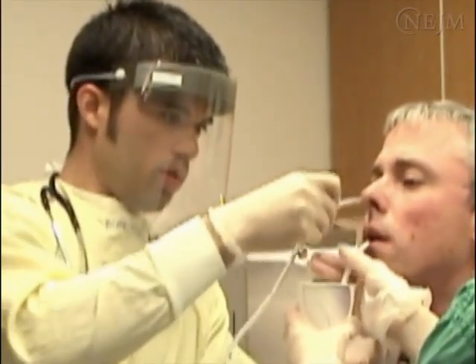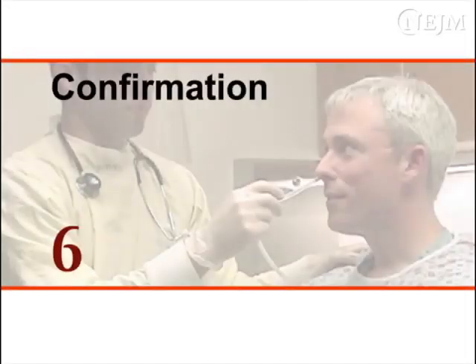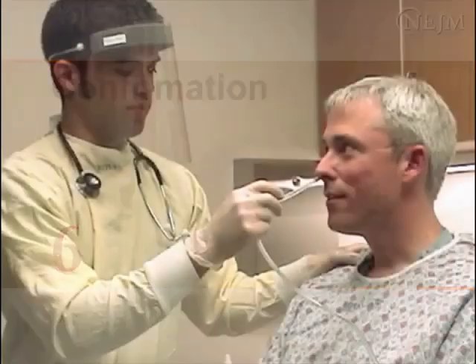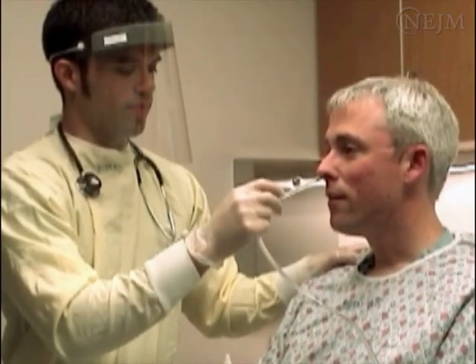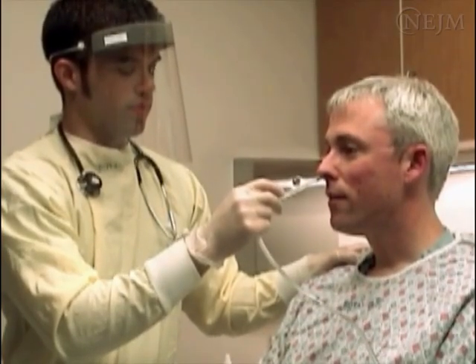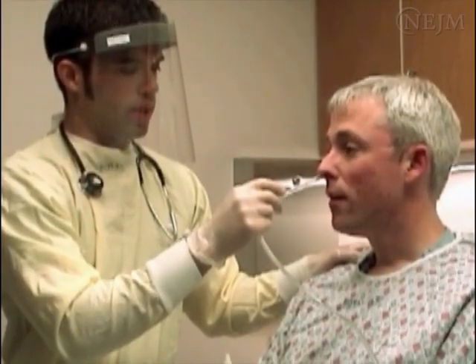Check the black markings on the tube to confirm proper depth of insertion. Assure that the patient is in no respiratory distress and is able to speak. If the patient is unable to talk, is in respiratory distress, or if respirations can be heard through the tube, it should be removed immediately, as tracheal intubation has likely occurred.